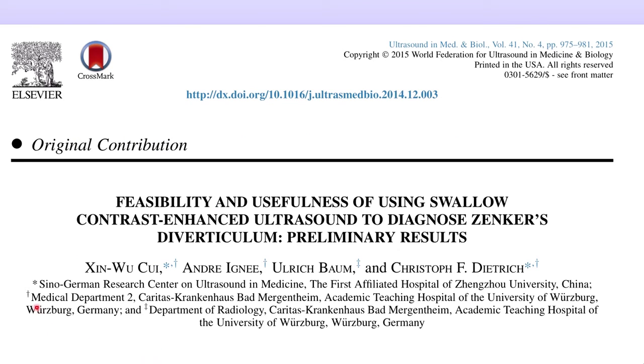In another study, we used the swallow contrast enhanced ultrasound to diagnose Zenker's diverticulum, and we published this paper in Ultrasound in Medicine and Biology.